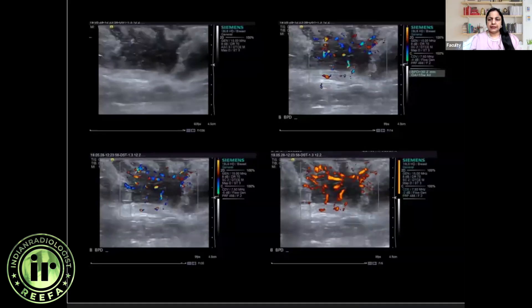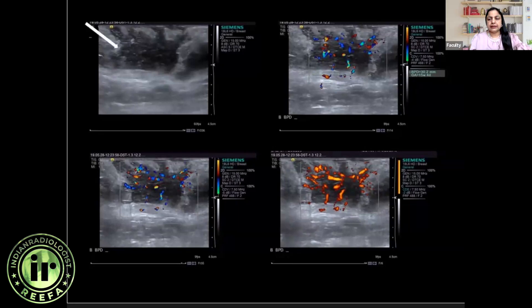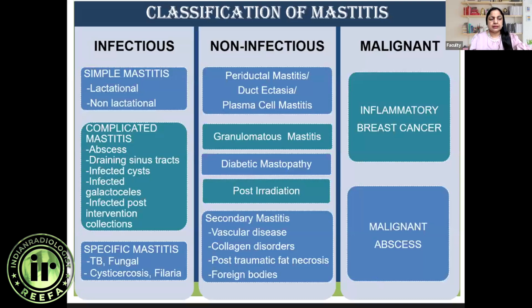This was a lactating patient who came with clinical features of mastitis. Ultrasound is the first imaging modality in these patients because they have pain and tenderness. In this patient we saw an ill-defined heterogeneous collection with marked hyperemia on ultrasound. We can help not only by diagnosis but also by aspiration to decrease the pathogen content, and patient recovery is faster once they are put on antibiotics.